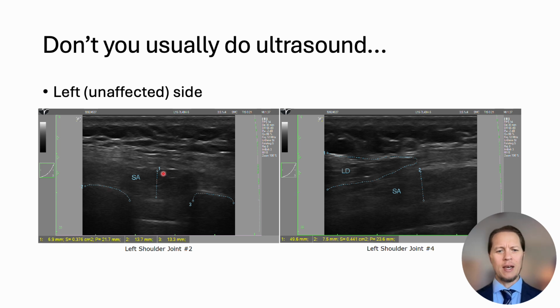It's coming. This is serratus anterior and the muscle thickness, nice hypoechoic muscle on the unaffected side on the left. That's the border of the rib. That's another rib, and that is pleura. That's why the serratus anterior is very close. When you're doing needle, you want to make sure you're right on top of the rib and not in between, otherwise pneumothorax. Here's the end of latissimus, also dark and hypoechoic, meaning healthy water-filled muscle, and then the serratus anterior as well. Thickness here about 7, so that's a nice healthy amount of serratus anterior.